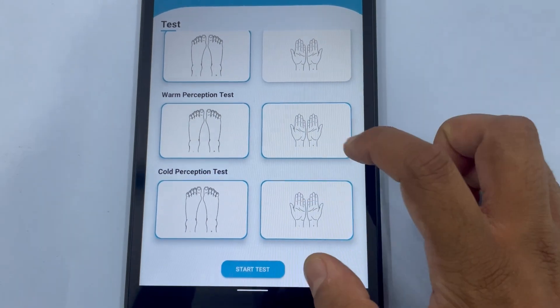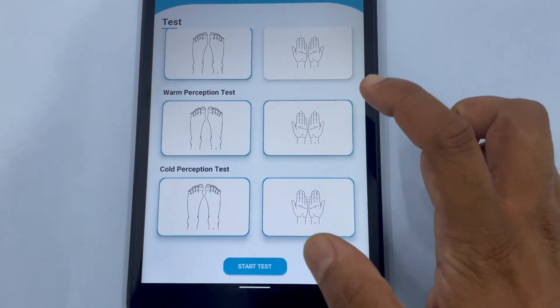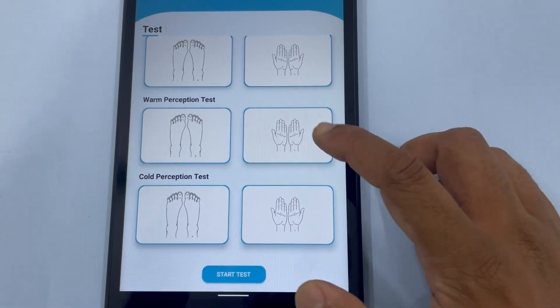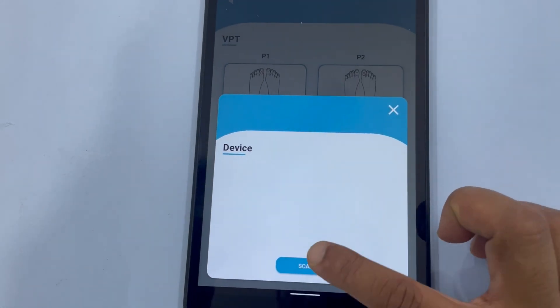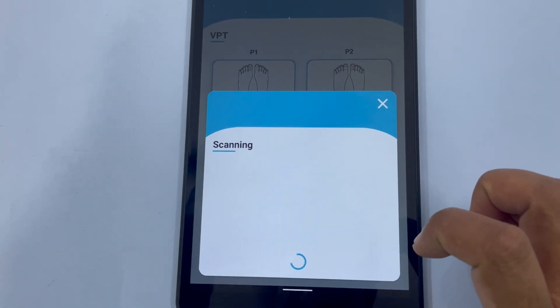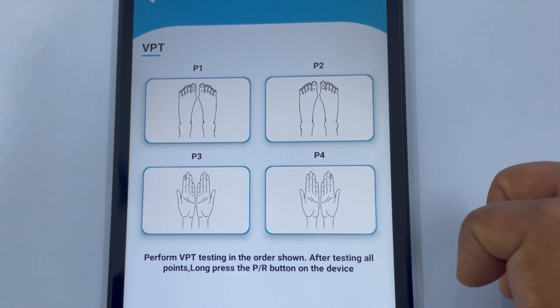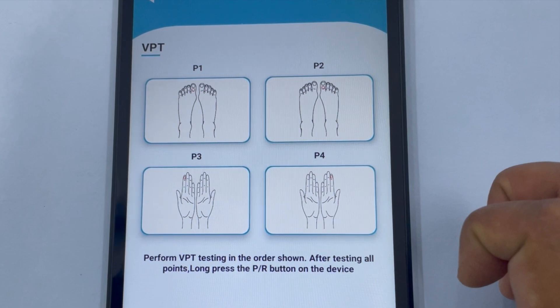Select the tests and the sites, then tap the Start Test button at the bottom of the screen. The first selected test will appear on the app screen. Avoid interacting with the screen — now proceed to perform the tests with your device.